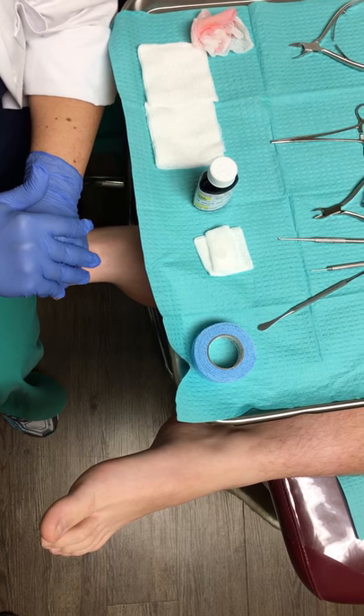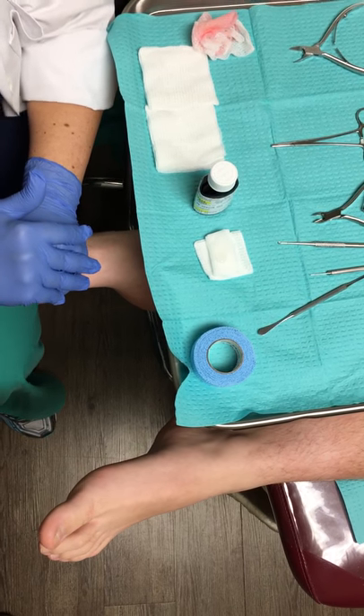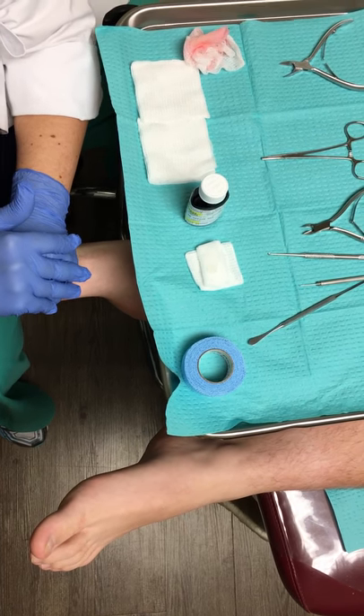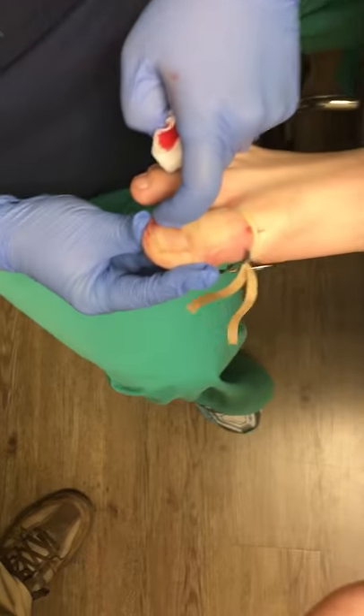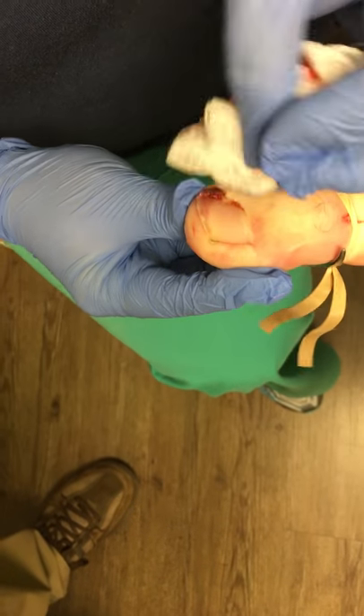I'm just waiting. So I have small hands, so I have to use both hands to clamp off a big toe. And sometimes I do have to pull out an extra rubber band, so don't be surprised if I do that. He had some extra granulation tissue, which is why it's bleeding a little bit more, and that's common as well.